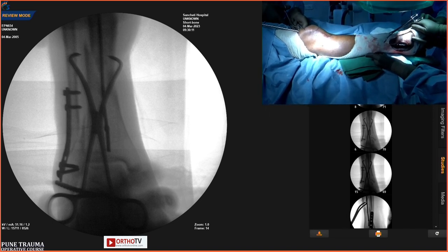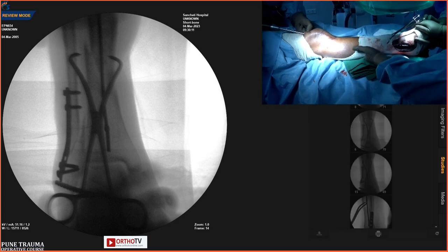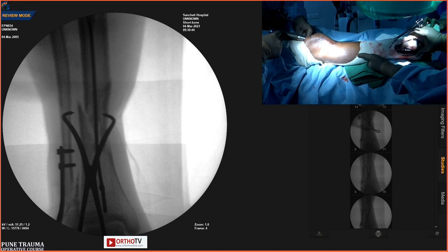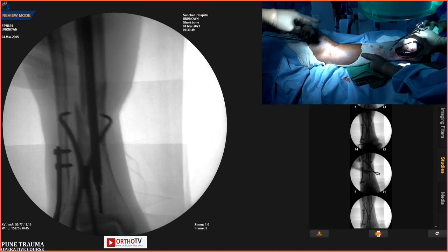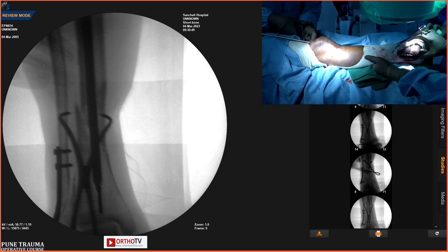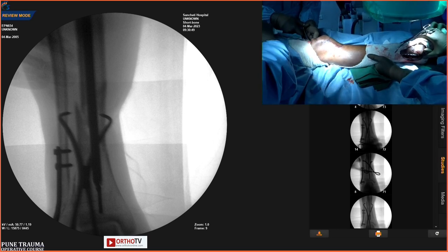We'll do it, sir. Okay. Certainly, I would like to go as low as possible. So what we generally do is that once you finish your reaming and exchange with the simple guide wire, at the end you can do a fixed reamer, 8 mm or 9 mm, and you can go till the tip.